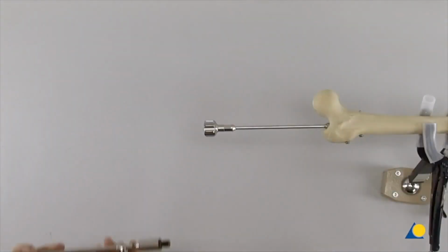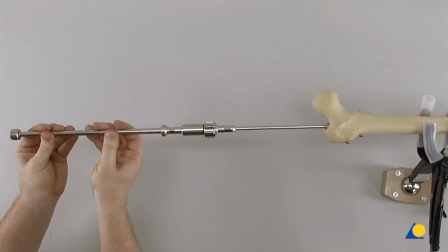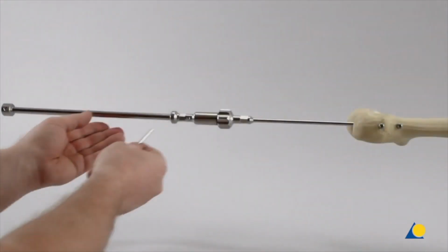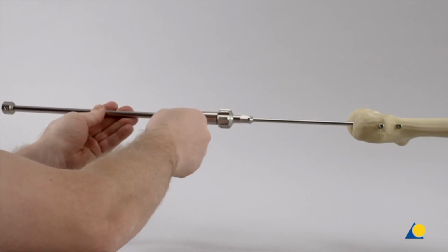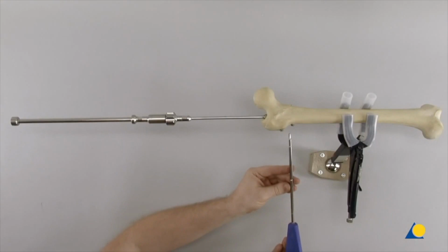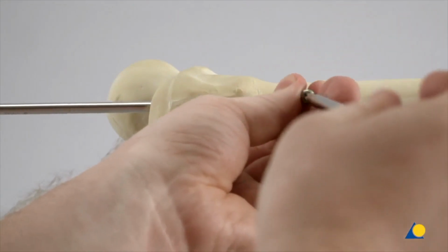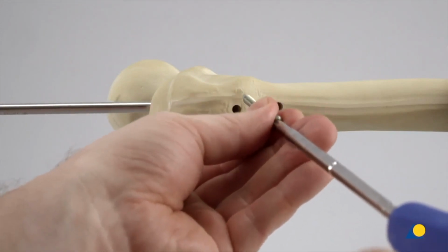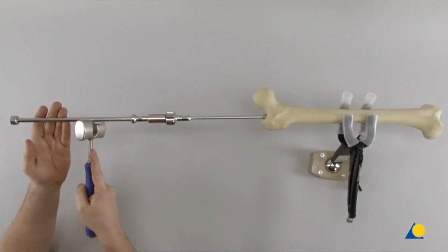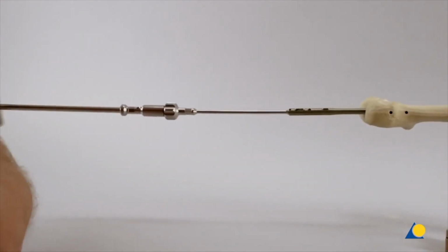The hammer guide is manually attached to the end of the extraction screw and tightened with the pin wrench. The screwdriver star drive T25 is used to remove the distal screw first, followed by the proximal screw. The combined hammer is slid over the hammer guide and lightly backslapped to remove the nail.